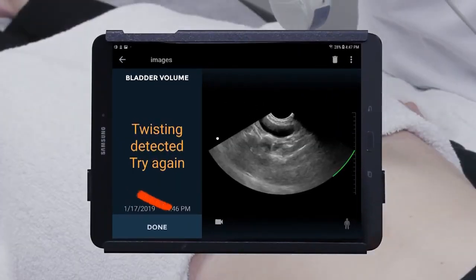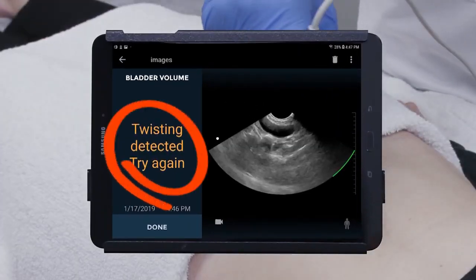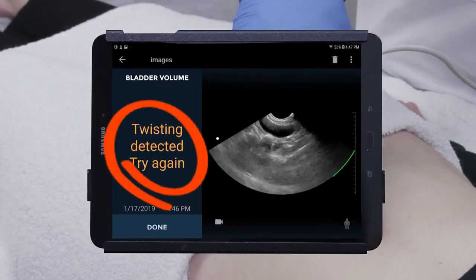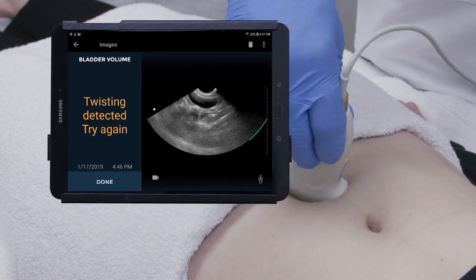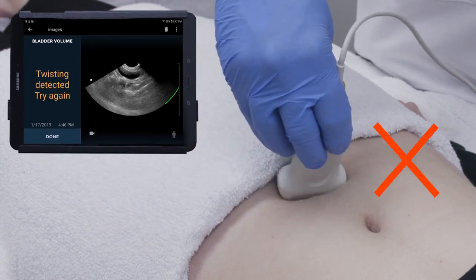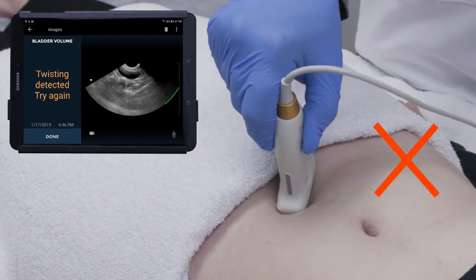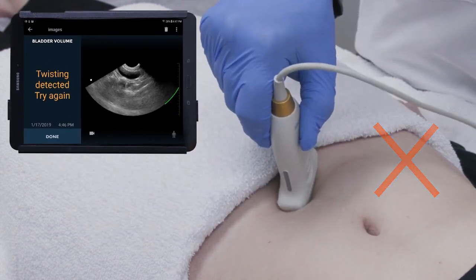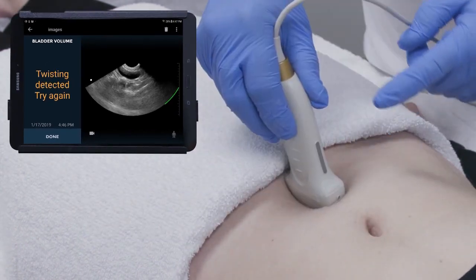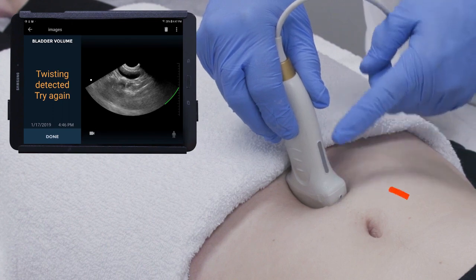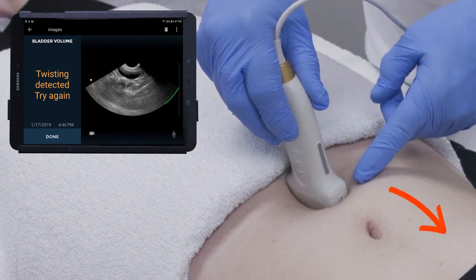If the phrase 'twisting is detected' appears, you should re-scan, taking care not to rotate the probe during the fanning motion, making sure the orientation marker remains pointing towards the patient's head.